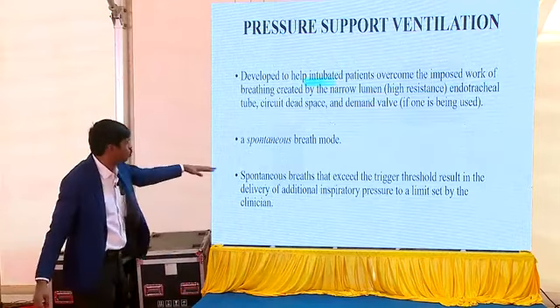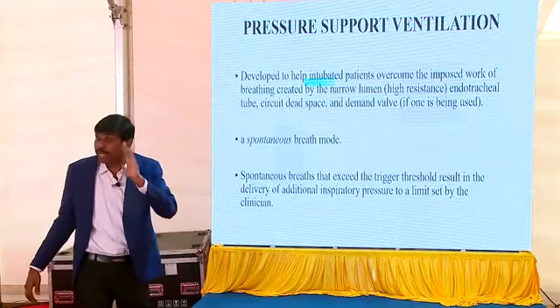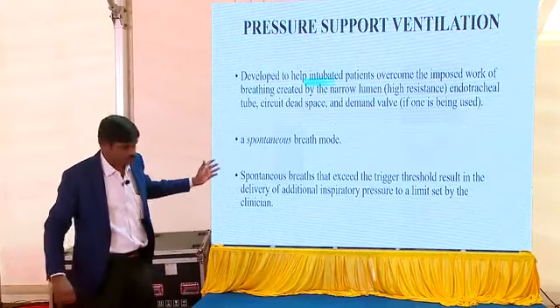Okay, that's all. And one more thing here is that the expiration is also controlled by the baby. That's called a flow.